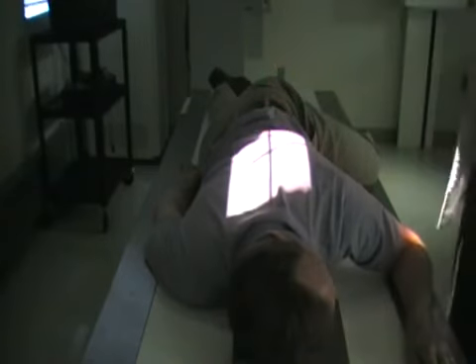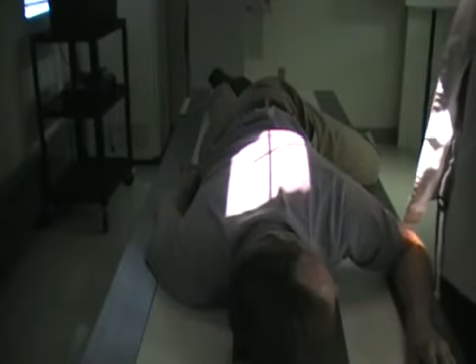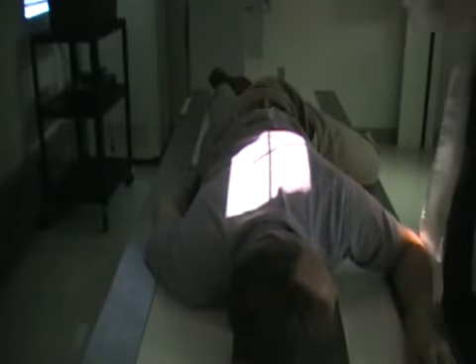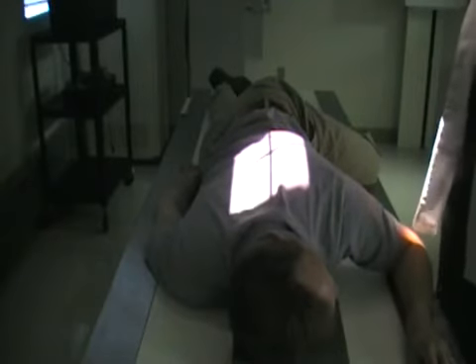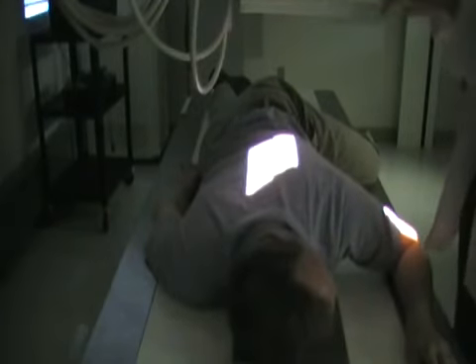Okay, and then our last point, which we need to do, is bring our distance in. Our SID is going to be 30 inches. So once you have it all set up at your normal 48 inch, you're going to then bring it in to 30 inches. The reasoning for that is because once you bring it in to 30 inches, your light field is going to be so tiny, and it's really hard to tell if you're at the right spot or not. So have it all set up at your regular 48, and then bring your distance down to 30 inches. And that is our RAO, oblique, for the sternum.